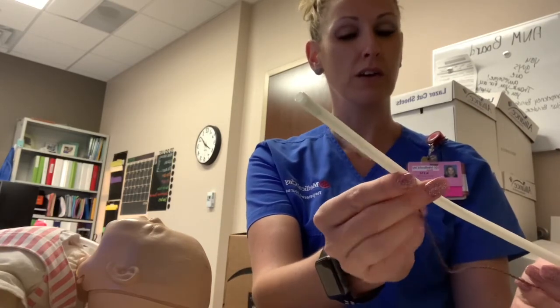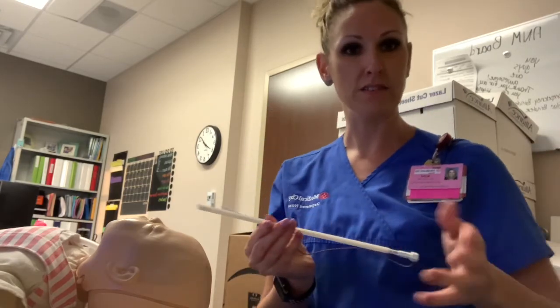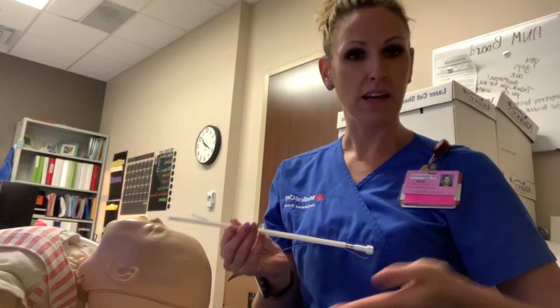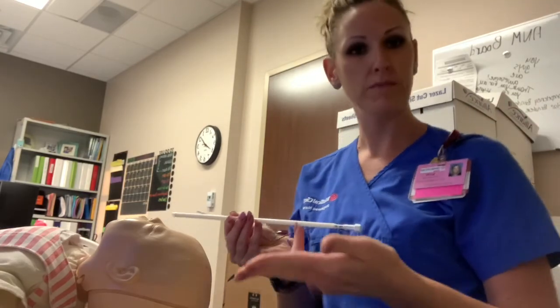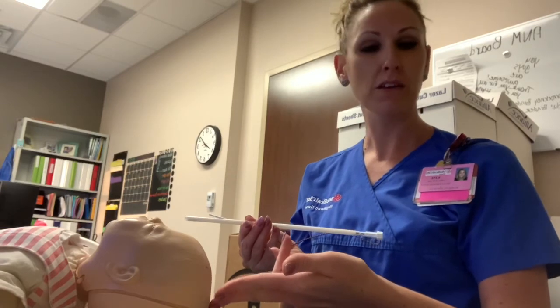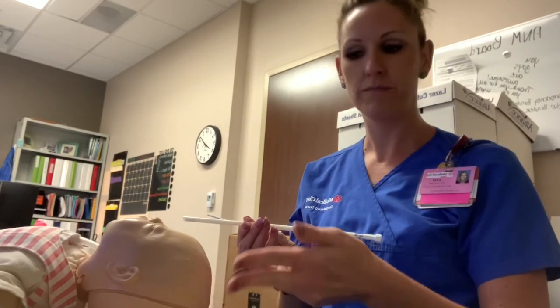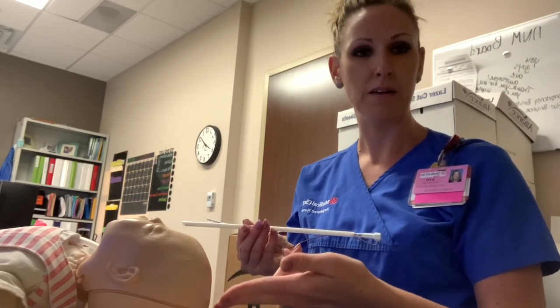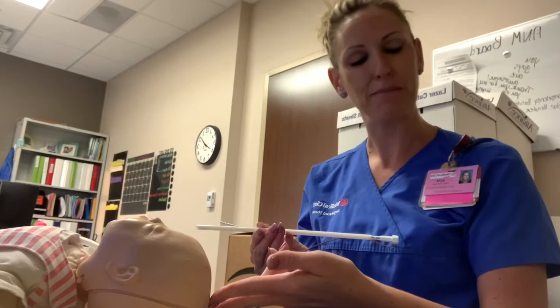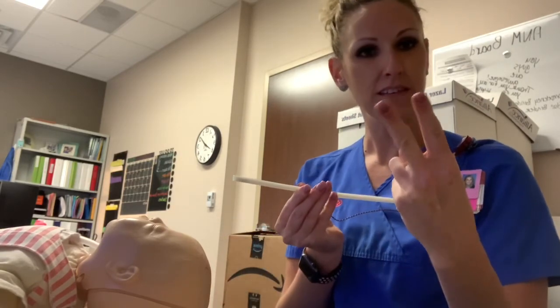Now that we have our fetal scalp electrode ready, we're going to go ahead and insert it. We're going to take our dominant hand, or whichever hand that you do a vaginal exam with. We're going to do the vag exam, find the fetal head. We're going to make sure that we go on a part that is not a fontanelle, that is not a buttocks or a foot or any other anatomy. We're going to put our fingers there, just like this, okay?